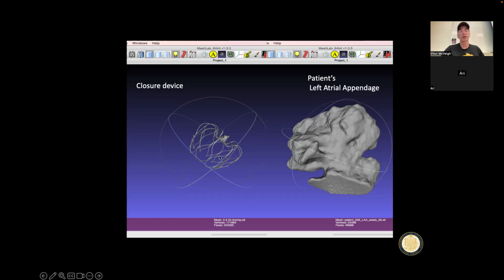What you do is you take this plug on the end of a wire and you put it right at the mouth here of the left atrial appendage, this is from CT, and you plug it in right here, and then you essentially shut it off. It's like a door. Then it endothelializes, and so the blood that's trapped inside the left atrial appendage cannot come back out, right? The alternative is you could just surgically go in here and cut this off right here and sew it up so that now you have a stump. You don't have a left atrial appendage where the blood goes down, sits for a while before it comes back out, right? That's surgical removal of the left atrial appendage.